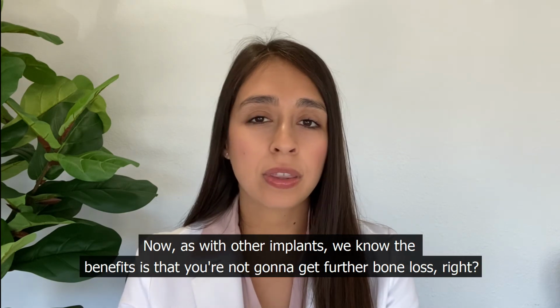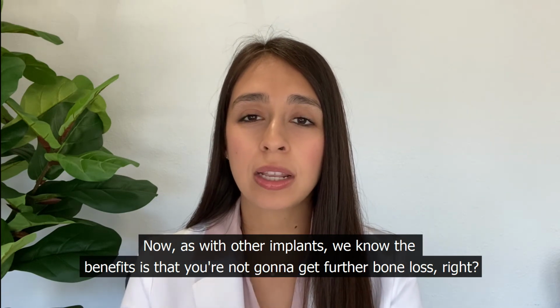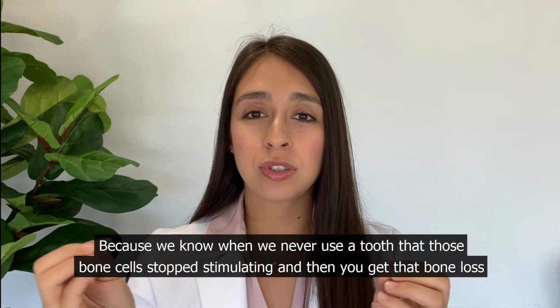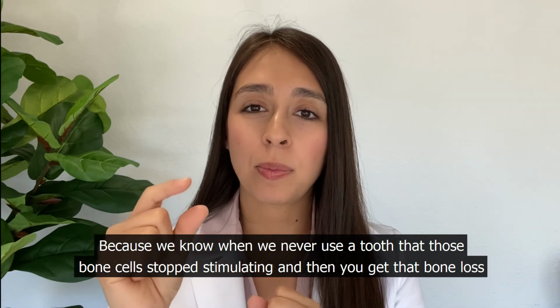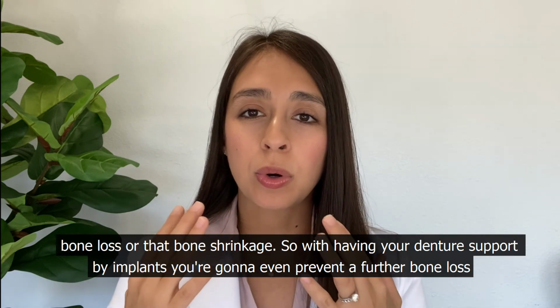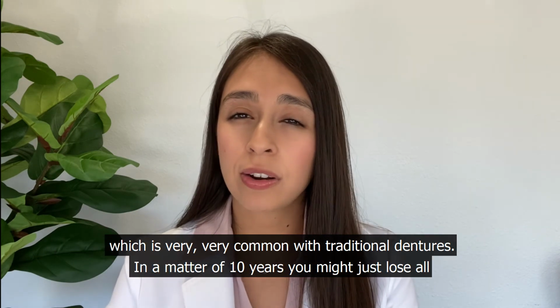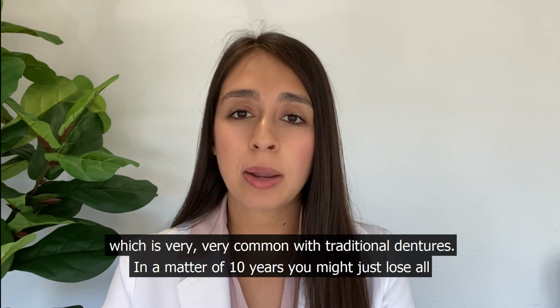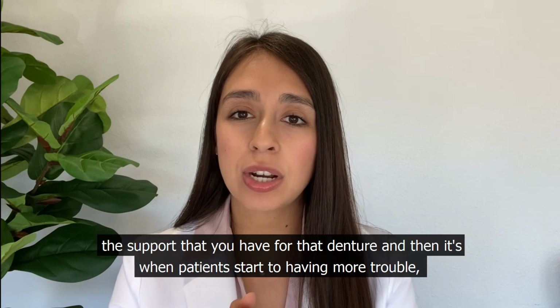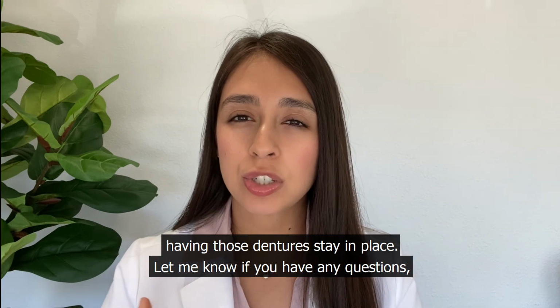Now, as with other implants, the benefit is that you're not going to get further bone loss, right? Because we know whenever you lose a tooth, those bone cells stop being stimulated, and then you get that bone loss or bone shrinkage. So with your denture supported by implants, you're going to prevent that further bone loss, which is very, very common with traditional dentures. In a matter of 10 years, you might lose all the support that you have for that denture, and then that's when patients start having more trouble keeping those dentures in place.